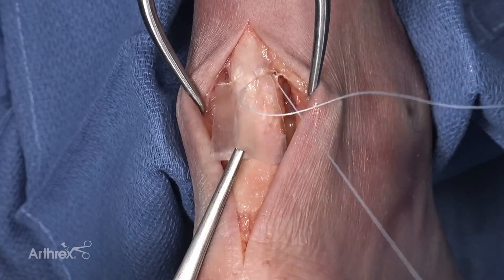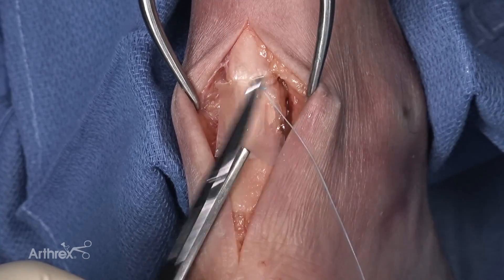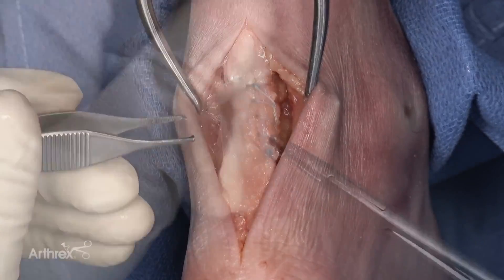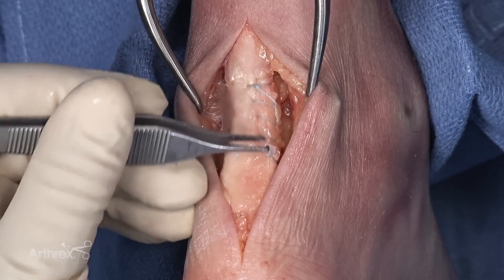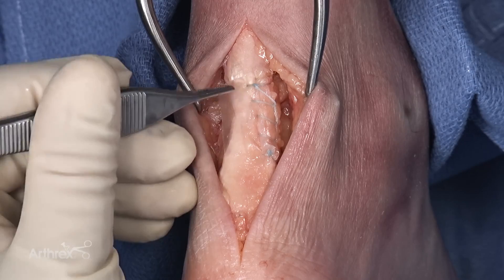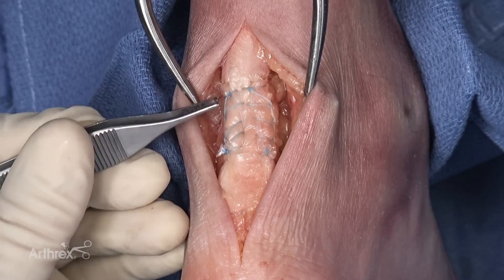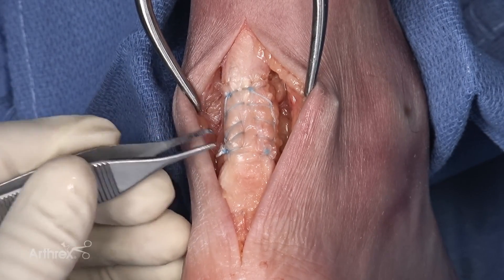Utilizing a medial running interlock and a lateral running interlock, we're going to create a seam across the center of the tendon where this scaffold is well affixed. The medial aspect of the scaffold has now amalgamated to the tendon, and we're going to do the exact same running interlock stitch with a second number two fiber wire on the lateral side of the tendon. This Achilles tendon rupture was repaired with an intrasubstance Bunel repair and was augmented circumferentially with Centiflex human connective tissue matrix.